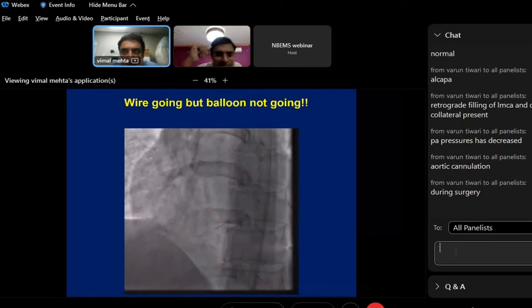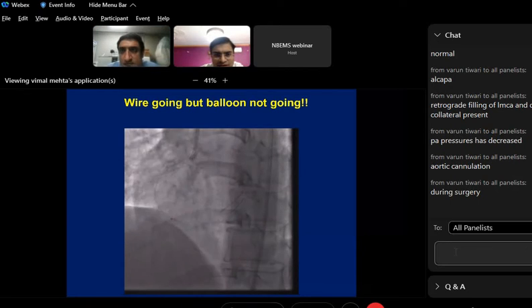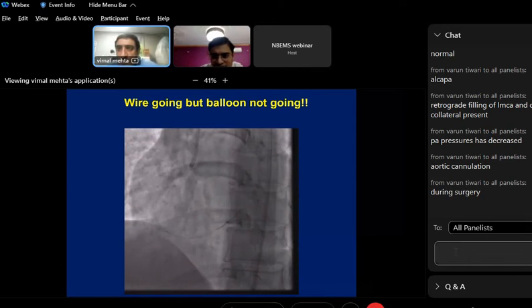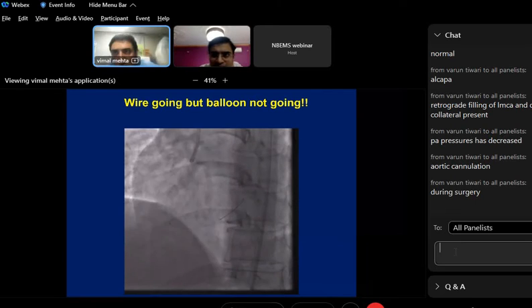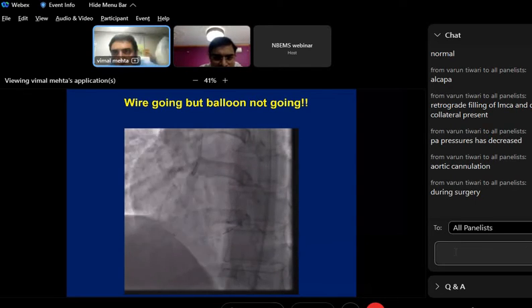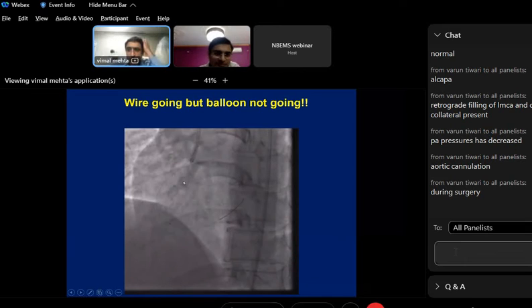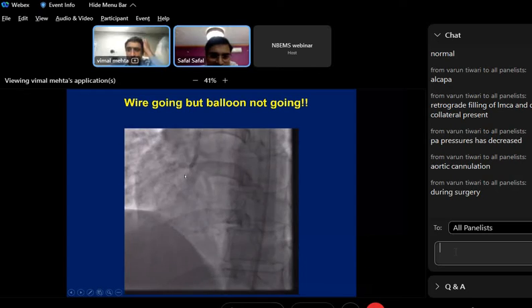False passage, from where? Yes, false passage to false lumen. Okay, calcium. Okay, so these are important. False lumen, calcium in front of the balloon. Okay, catheter is not hooked. So these are all problems which can be there. But here, the wire is subintimal. Okay, very good. See from where the wire is coming out. Now, all your answers are correct.